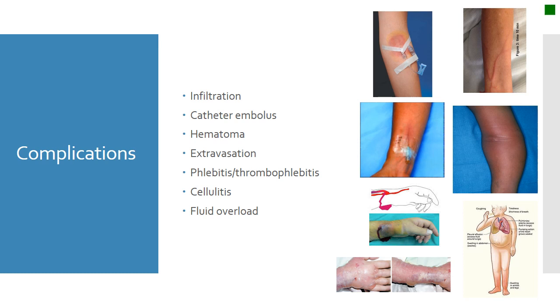To prevent this, you need to use an infusion pump and monitor their intake and output. If fluid is going in, fluid should be coming out. If it's not coming out, it's going somewhere else, and you need to check where it's going.